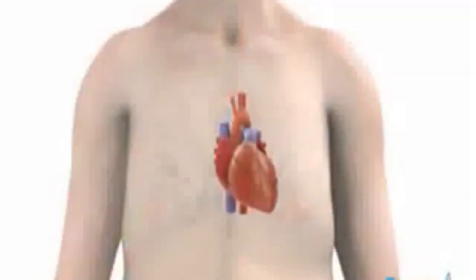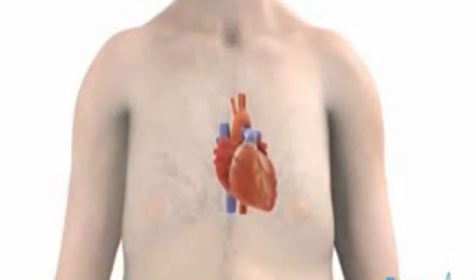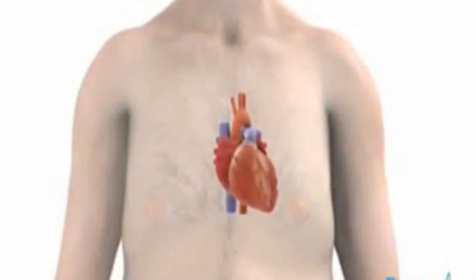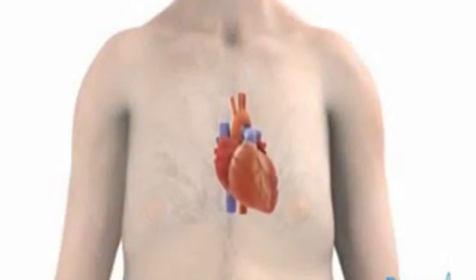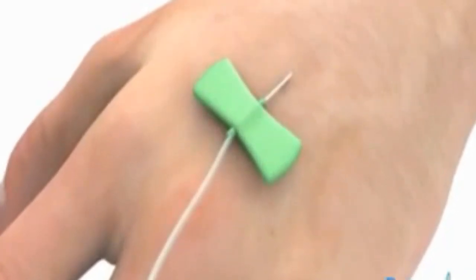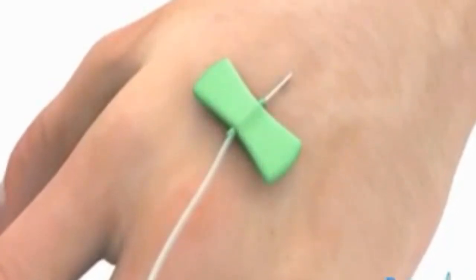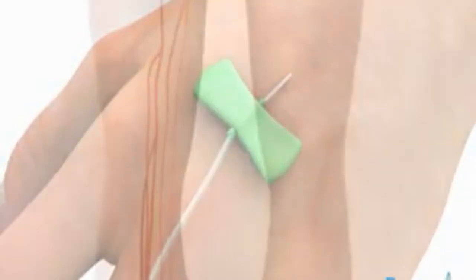A coronary bypass graft, or CABG, can bypass the blocked arteries so that blood can flow more easily. A CABG is carried out under general anaesthetic, which means that you'll be asleep during the procedure and feel no pain.